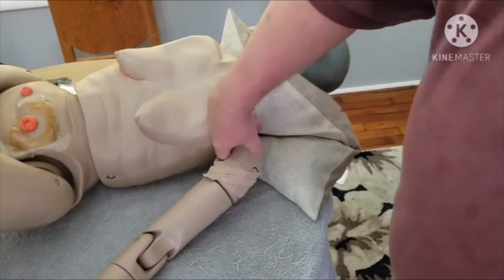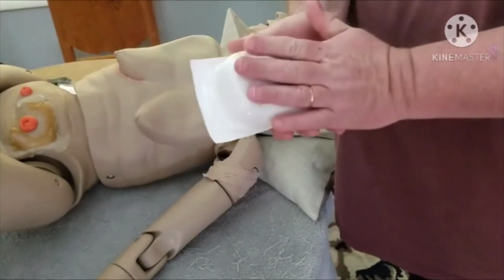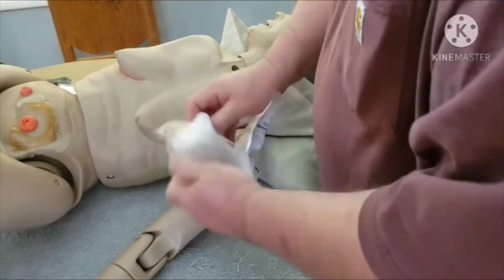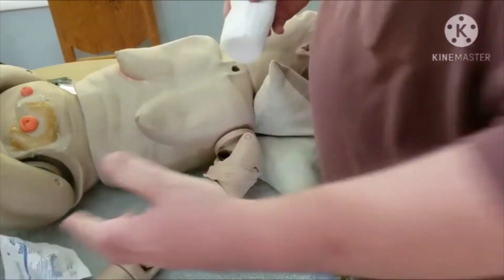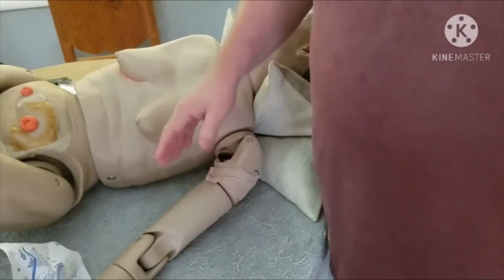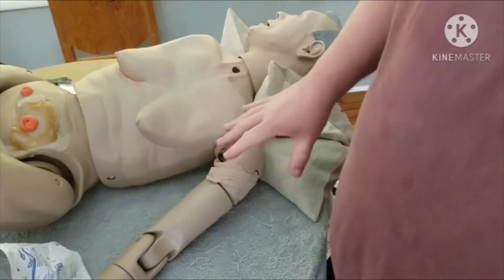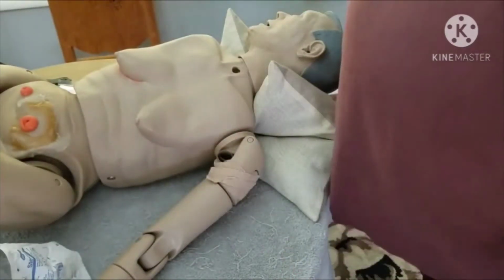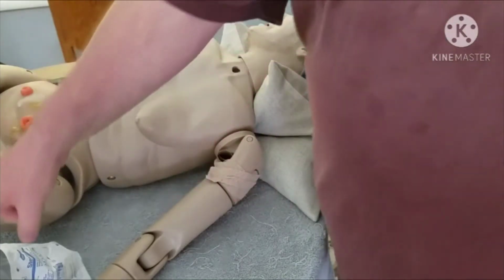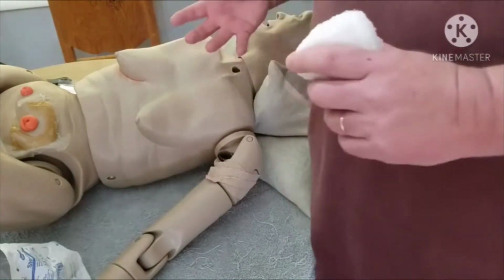The best way is to pack it. And if you're going to use our IFAK, you're going to use our gauze. So you want to open it. And the best way to do this, first off, if you come across a wound like this, first thing you want to do is apply pressure to it. If they're on the ground, if you've got nothing else, take your knee and put your knee right on that spot and keep pressure on it while you're getting your stuff ready. If they're conscious, you can ask them to use their arm and apply pressure there. You might even want to take your ABD dressing, put it over it, and have them holding pressure there while you're getting this stuff ready.